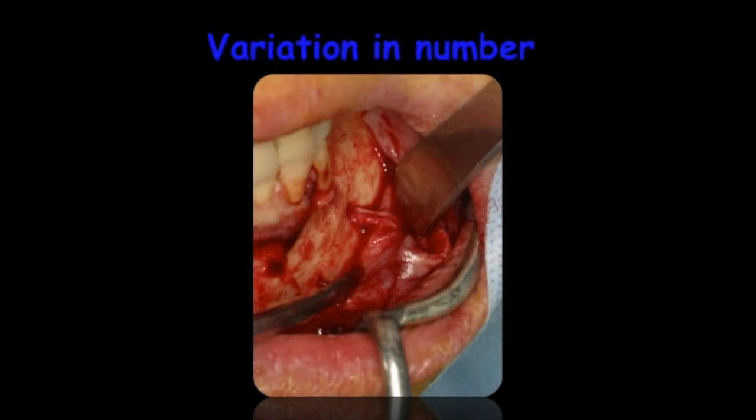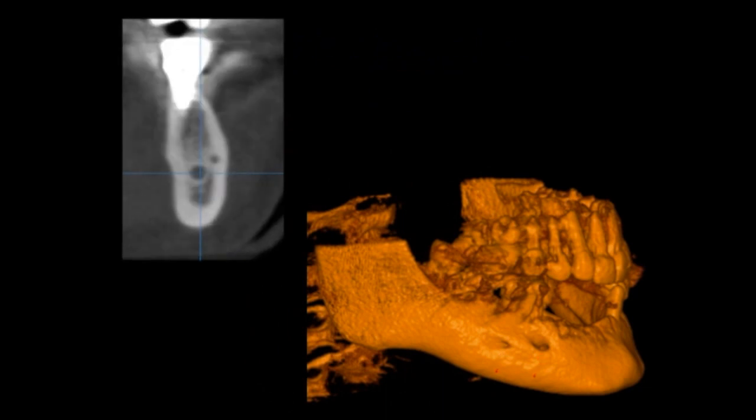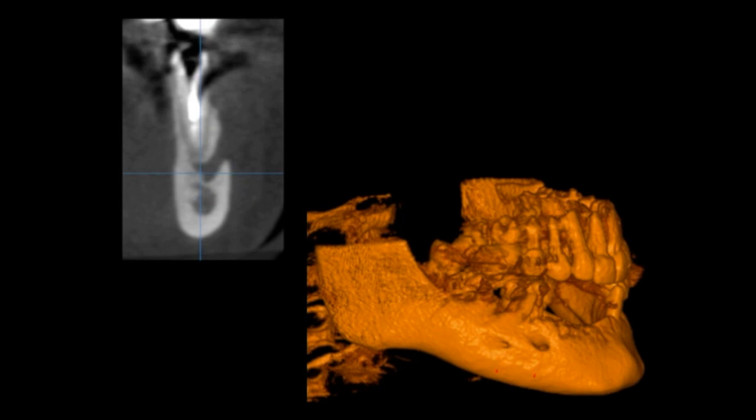Usually the mental foramen is unique, as you can see on this clinical image. And in 7% of cases, as we can see on this 3D rendering and on the sectional sequence, we may have a double mental foramen.